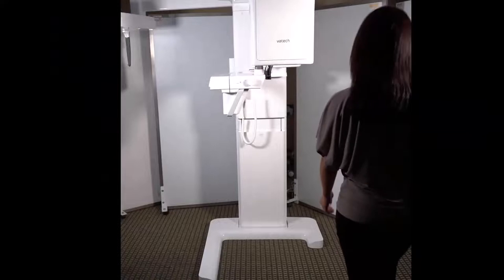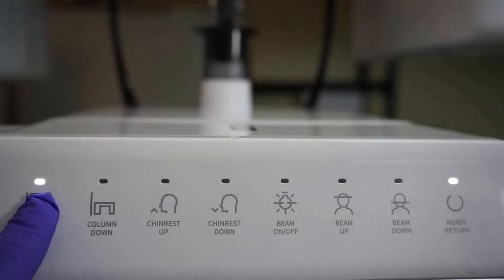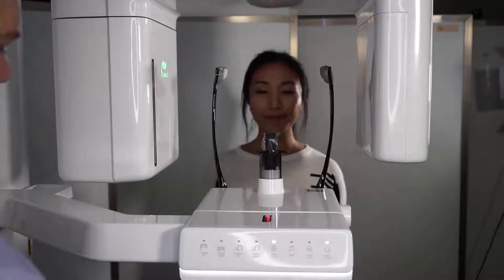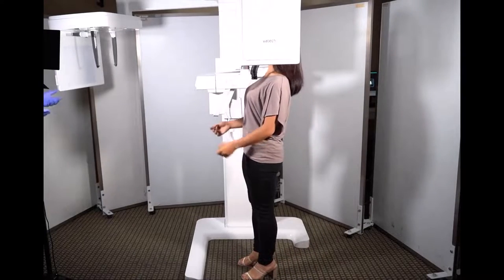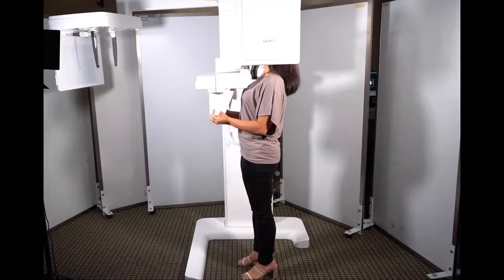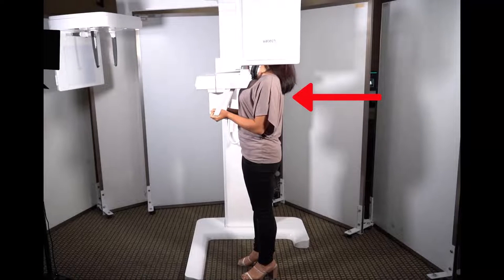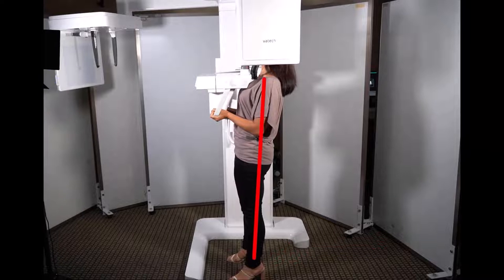As our patient enters the machine, adjust the chin rest height by using the column up and column down buttons on the front of the panel. As the patient enters the machine, take care of the hands first, the feet second, and then the bite in that order. Grasp the hand rails with palms facing up. Feet should be at shoulder width apart for stability.